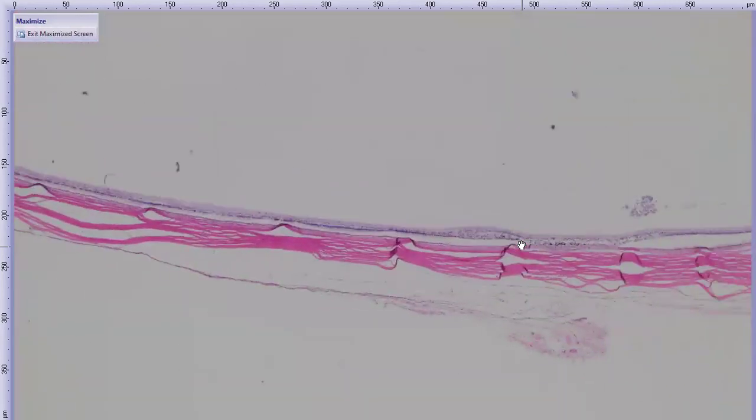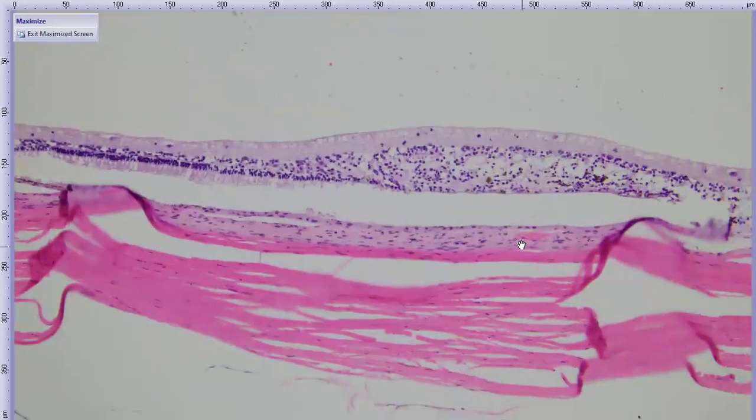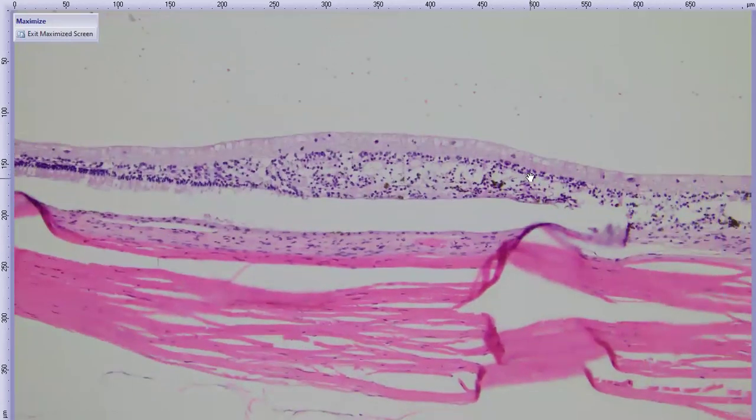And then we'll skip over to the, so way over here, also in the dorsal and very peripheral retina. We have a more normal retina over here, and then as we walk in this direction, outer to full thickness atrophy. And actually right here at this site, not only is there outer atrophy of the neurosensory retina, but the retinal pigment epithelial cells in this area are lost. So we have some unusual multifocal retinal changes in this case, with pigmented cells kind of diving into the retina itself.